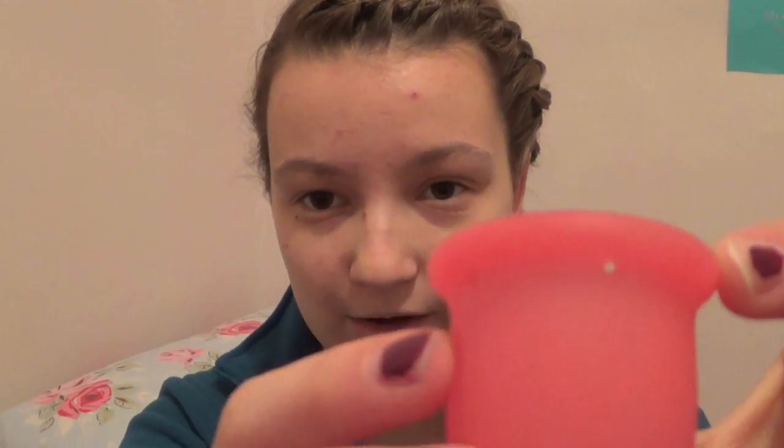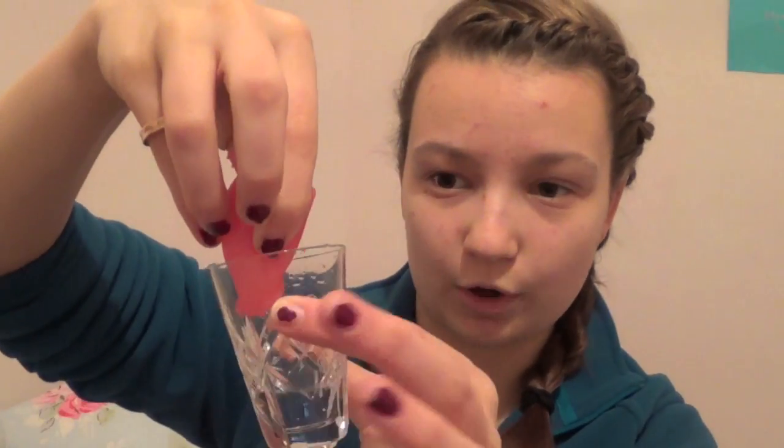So, now how can you help your cup to open? One of the tips I have is to look at your cup, and your cup has these little air holes you can see there. If you do the punch down fold, punch down over one of those holes, and then you can see you kind of form the air pocket in there right over one of the holes. That should help to open up your cup, like so.